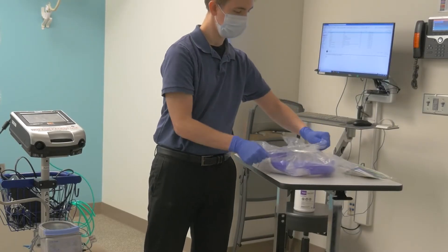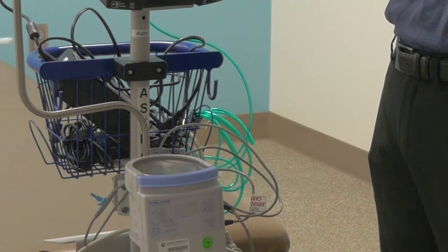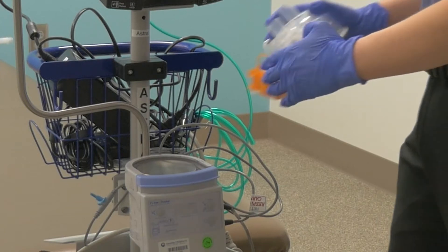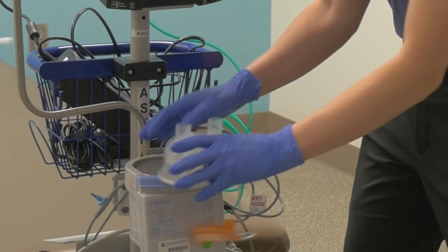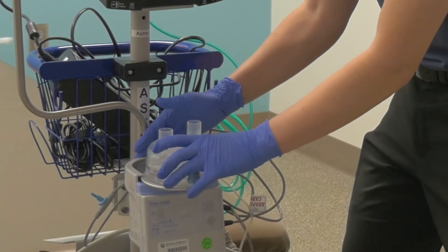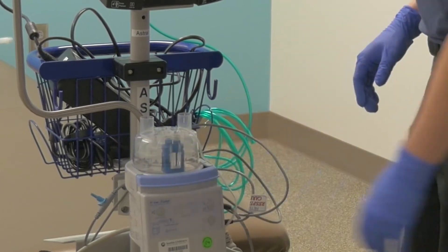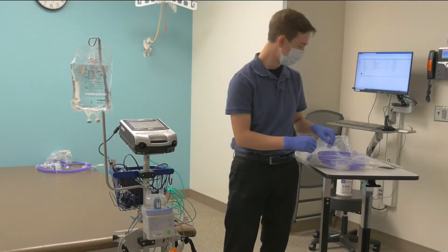First, remove the humidifier water chamber from the packaging and carefully slide it onto the top of the humidifier. The chamber typically clicks when it's far enough in. Gently tug on the chamber to make sure it is in securely. Make sure the chamber is inside the securing lip on the humidifier and not accidentally above it.